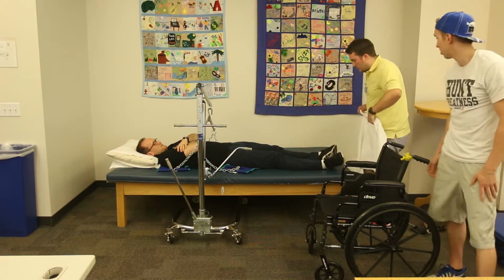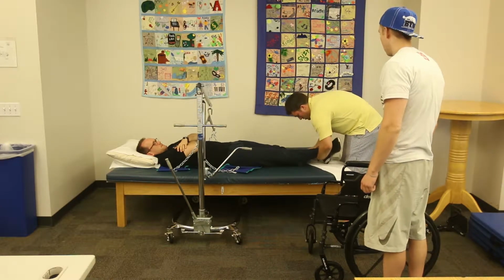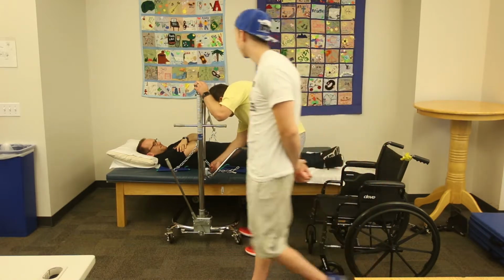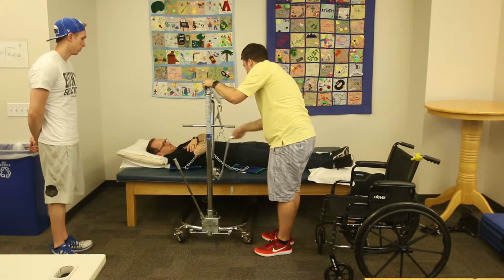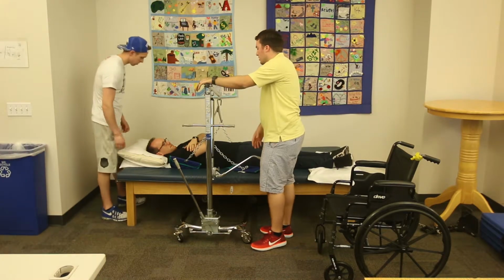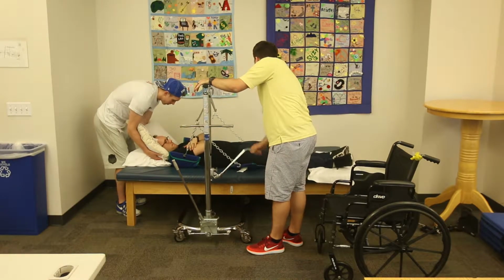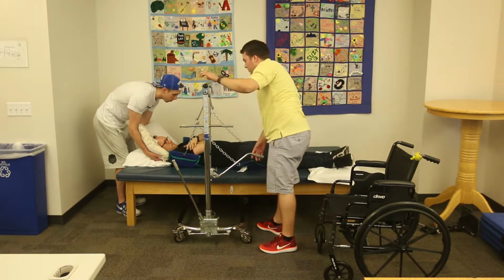We're gonna put this towel underneath your feet so they don't rub when we move you. How you feeling there, Lucas? Great. Good. That's what we like to hear. Ready for lunch. All right, now as I bring Lucas up, if you want to just get behind his head and just support it so that he feels nice and secure as we're going up. There we go.